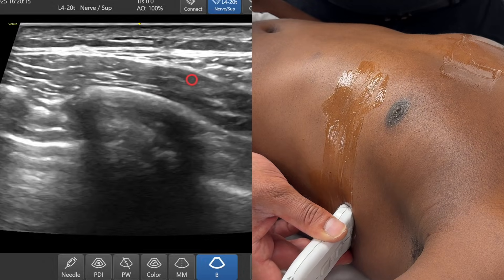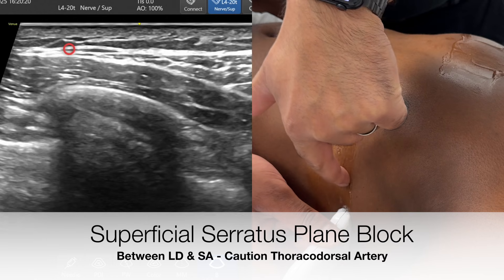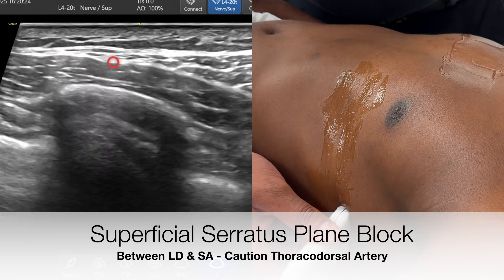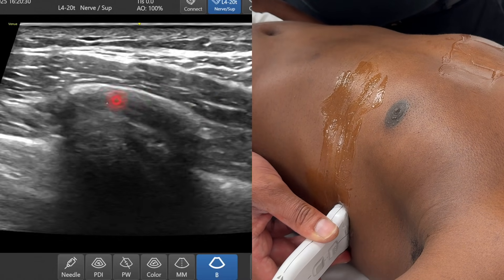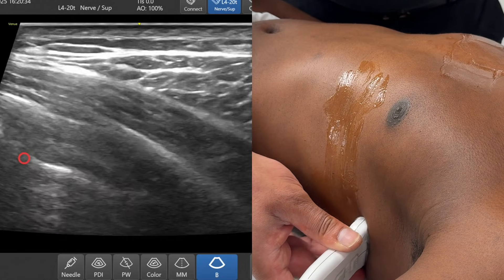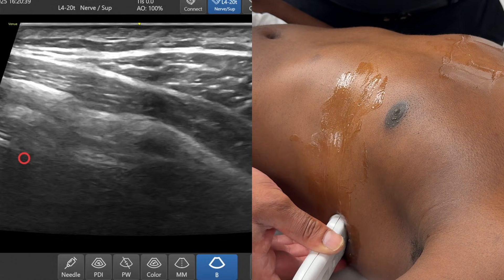To perform a superficial serratus anterior plane block, you're aiming to bring a needle from anterior to posterior, and you want to deposit your local anesthetic in the plane above the serratus anterior muscle, separating latissimus dorsi from serratus anterior. Here's rib, here's pleura. A lot of people advocate doing this block because it's far away from the pleura and they believe it's safer.